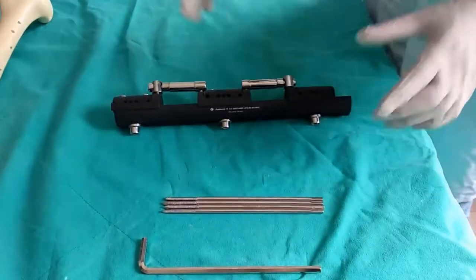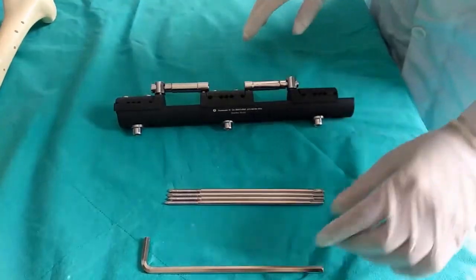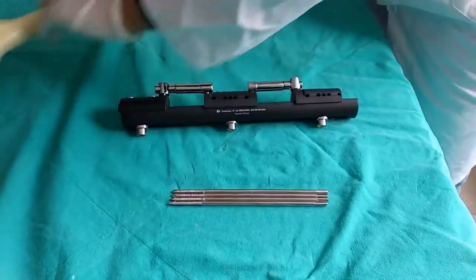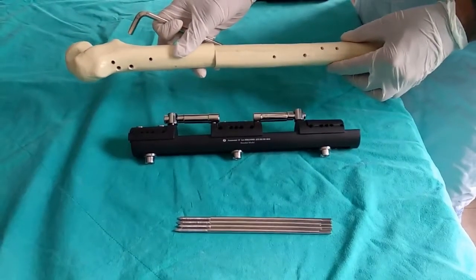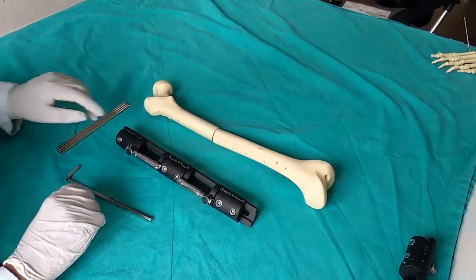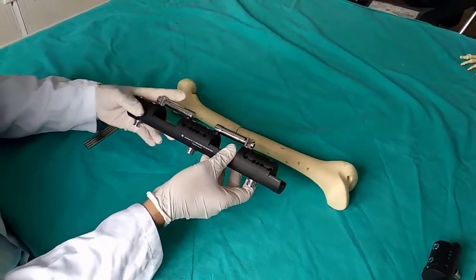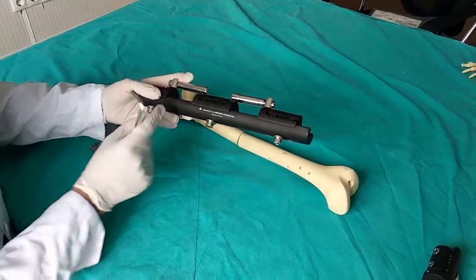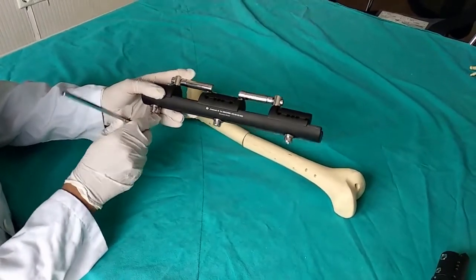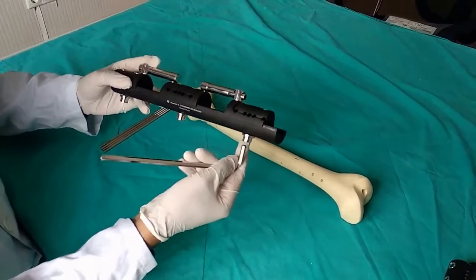After sterilization, the first thing the surgeon does is choose the appropriate size for the bone. We'll demonstrate the surgical technique on the femur. With the fixator ready, we loosen the clamps by inserting the Allen key and turning. We loosen all three clamps.